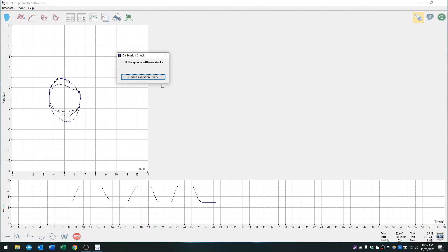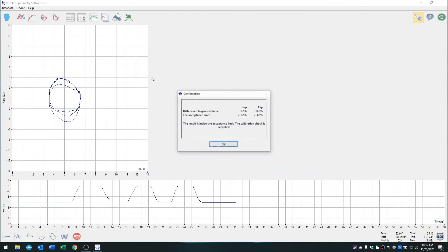You can see here it says that the result is inside the acceptance limit. Calibration check is accepted.